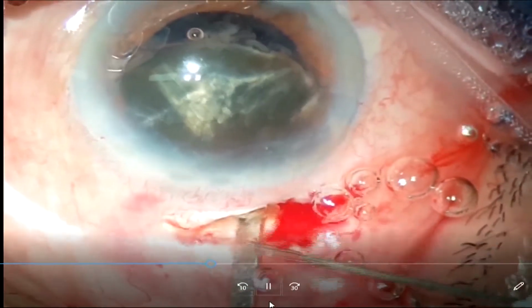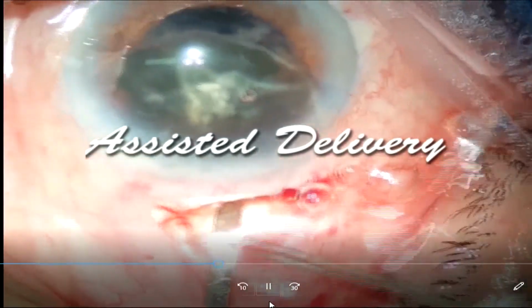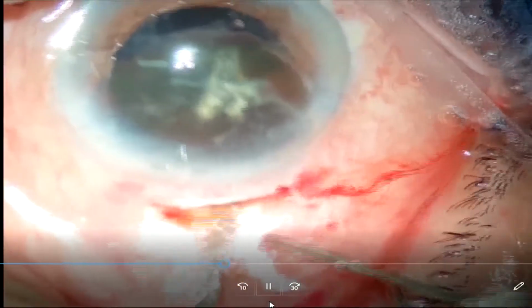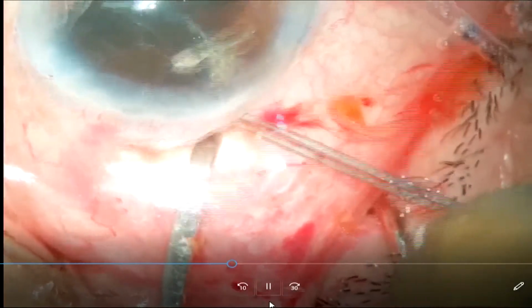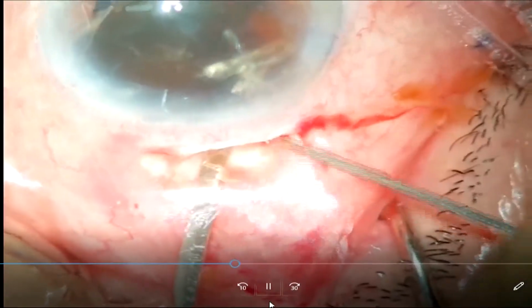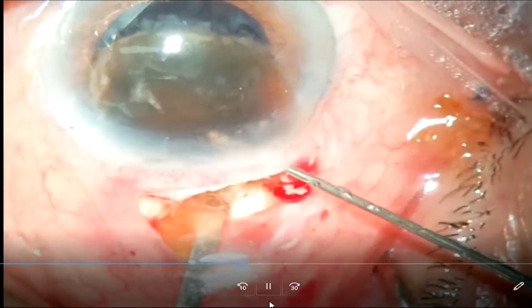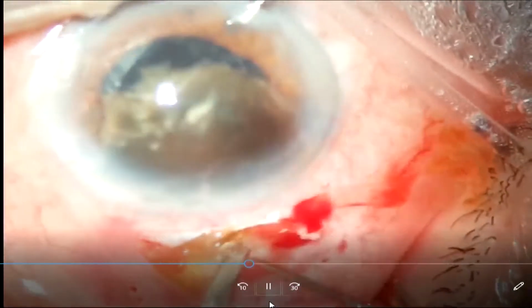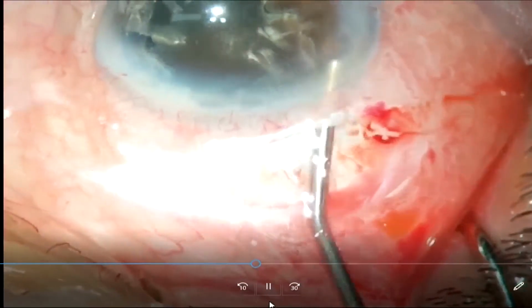After that, this is an iris repositor which is placed behind. I keep pressing on the sclera. The fluid is on, and the needle in the other hand is chipping the nucleus so that the nucleus becomes smaller in size. As the nucleus becomes smaller, you can keep on pushing the nucleus back to engage the smaller diameter. And eventually, as the nucleus engages into the internal tunnel, suppose the nucleus does not engage, that means your internal opening has to be enlarged.